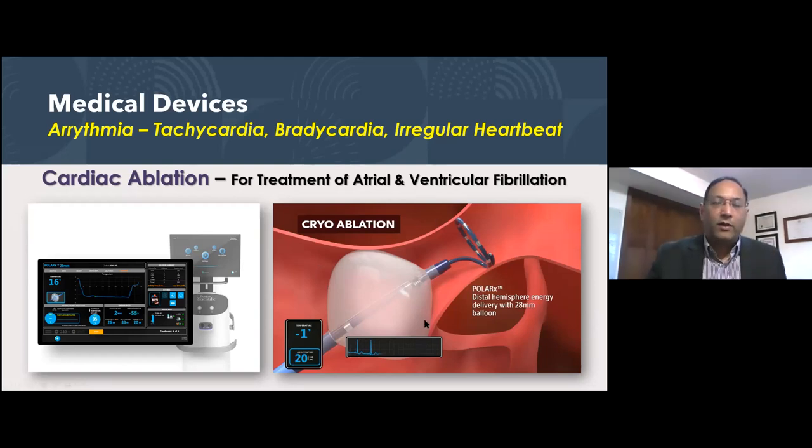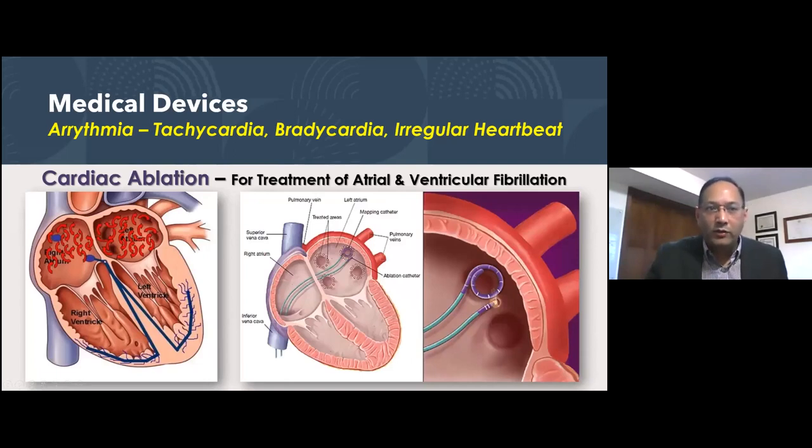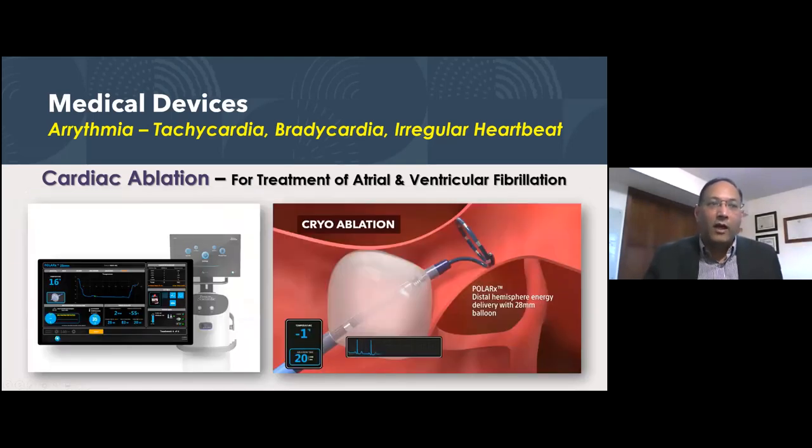It comes with a balloon. So when you had to do ablation point by point, you can put a balloon in there and then you can burn a circle really quickly. So this cryotechnology is gaining a ton of ground, and a lot of the companies are coming out these days with cryotechnology using nitrous oxide and, you know, balloons.